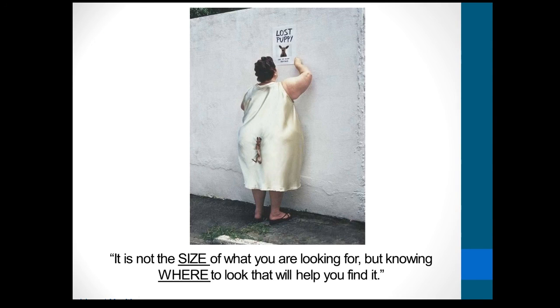So I think we can see quite a lot of deep infiltrating endometriosis, and it is more common than we think, particularly in patients with significant symptoms of endometriosis, dysmenorrhea, dyschezia, bleeding from the bowel, or infertility. So it is important in those women to have a detailed look also at the pouch of Douglas. And it is not the size of what you're looking for, but knowing where to look that will help you find it.